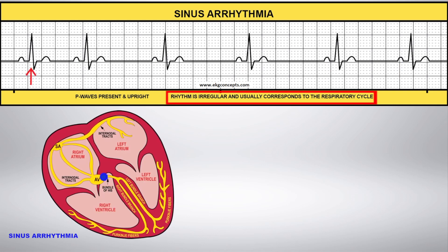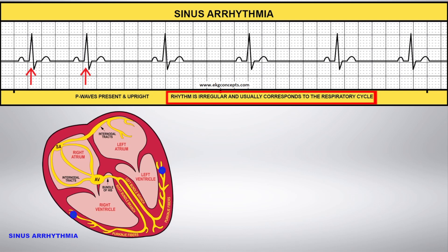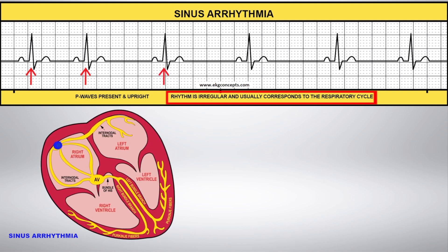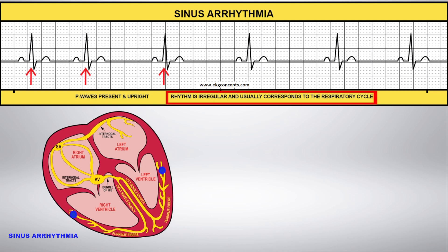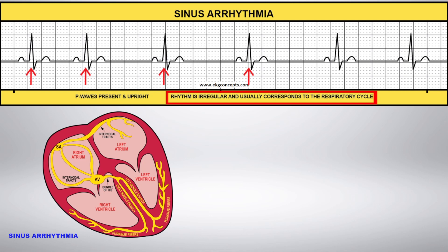With sinus arrhythmia, the impulse originates in the SA node and follows the normal electrical pathway, but the heart rate is irregular. Sinus arrhythmia usually corresponds to the respiratory cycle of the patient.